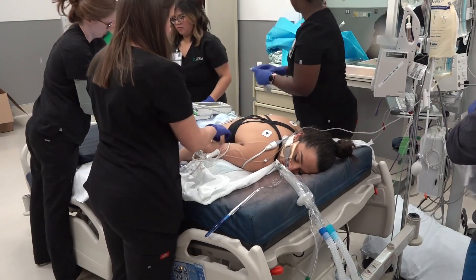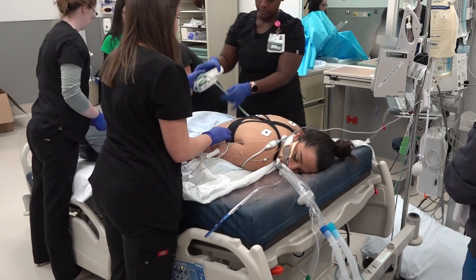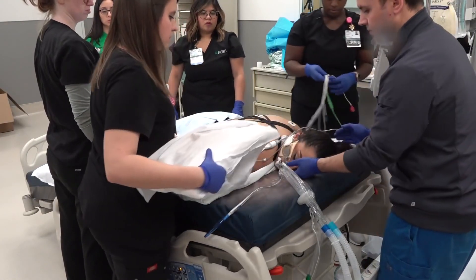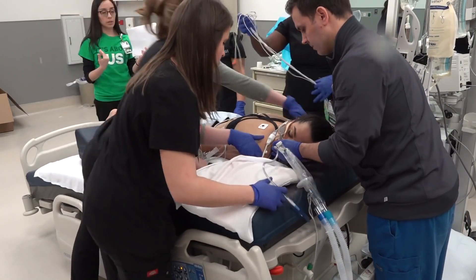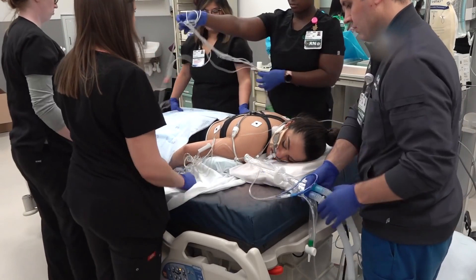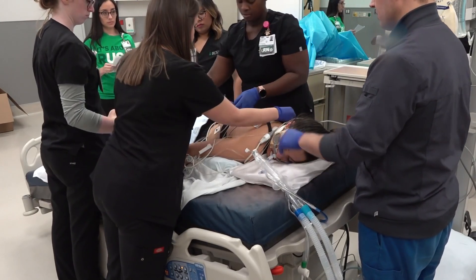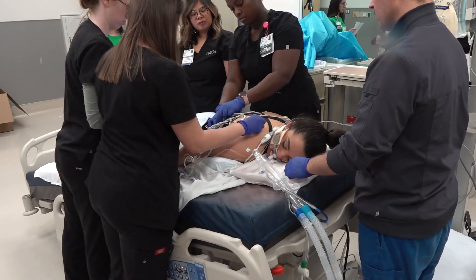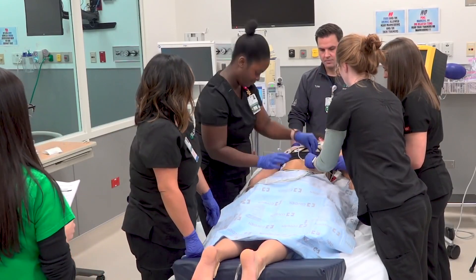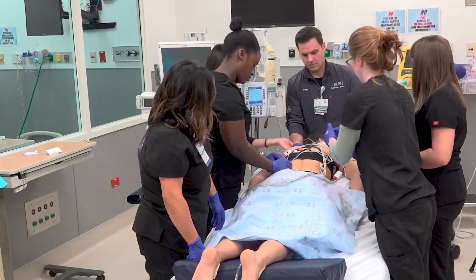At this time, we will also level and zero our invasive monitoring equipment. We will use a fluidized positioner which will be placed underneath the patient's head, and the respiratory therapist will be assisted in helping to elevate the patient's chest. The patient's ears will be checked to ensure they are not being compressed, and foam dressings may be applied to prevent pressure injury. Assess the face for bony prominences and mold the fluidizer pillows so that pressure points are offloaded and both eyes can be visible.